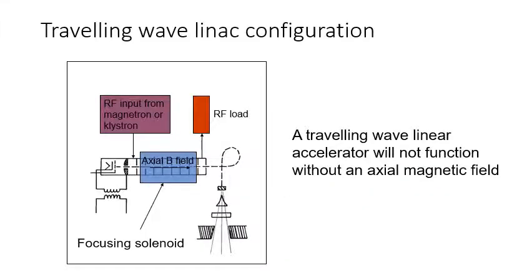The University of Alberta system was adapted to exploit a different linear accelerator geometry where magnetic interference is not problematic. Many linear accelerators require an axial magnetic field to keep accelerating electrons axially focused. Traveling wave accelerators are dependent on this focusing mechanism, as well as accelerators using the energy switch. The University of Alberta system exploits this mechanism in order to bring the linear accelerator and MRI in close proximity with each other and not suffer from magnetic interference.